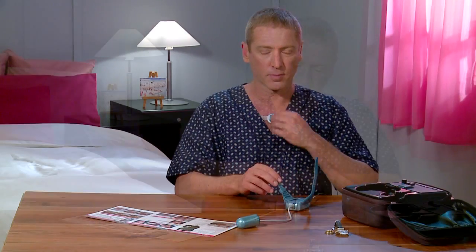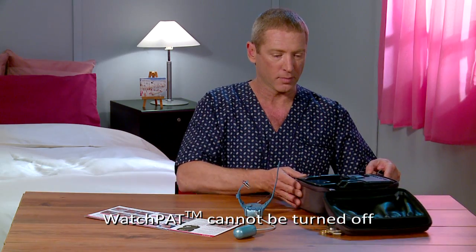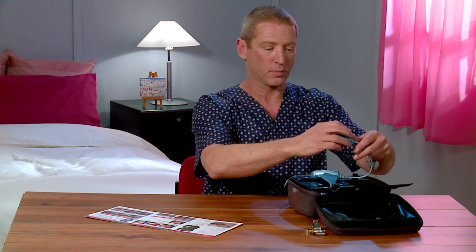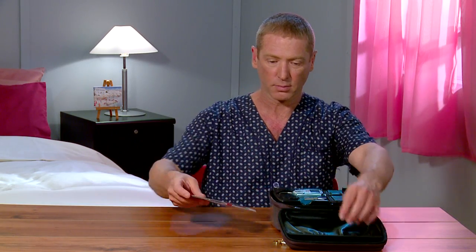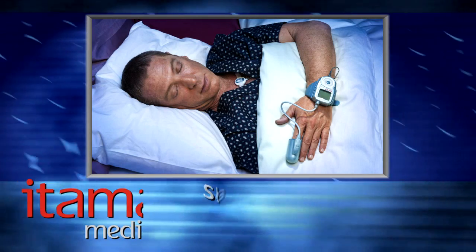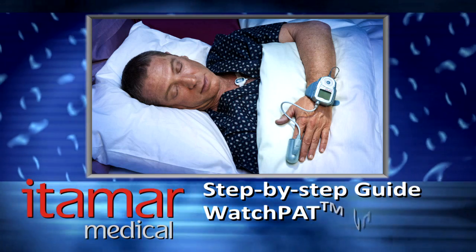Note that the WatchPat cannot be turned off. Return the device along with the PAT probe and the SPP sensor (if attached) to the case. Return the illustrated guide to the case as well. That's all there is to it — if you follow carefully the steps presented here, you should have a successful WatchPat sleep diagnostic test.